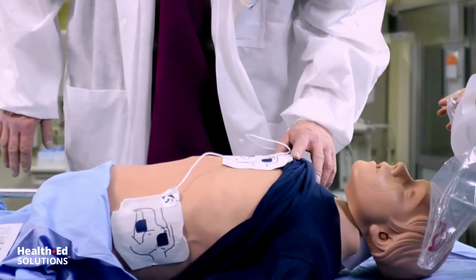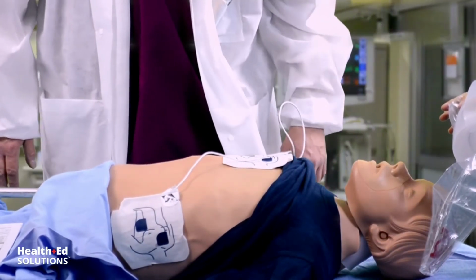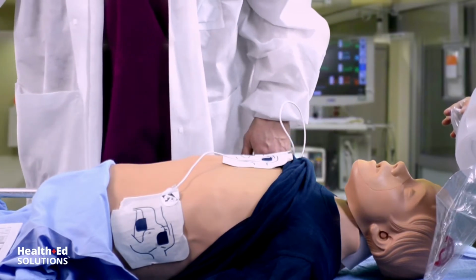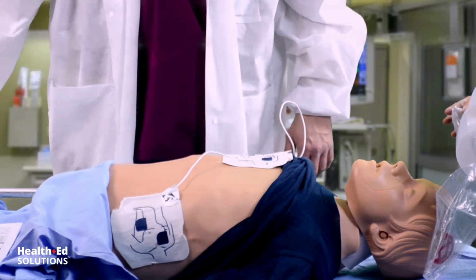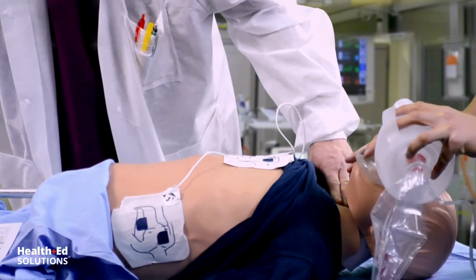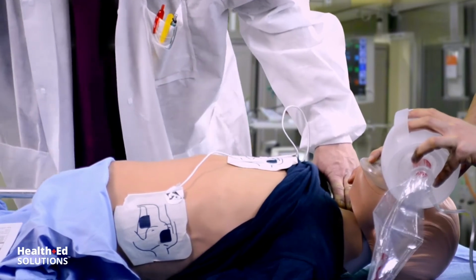Analyzing rhythm. Do not touch patient. Analyzing rhythm. Check pulse. If no pulse, give CPR. This kid's got no pulse.